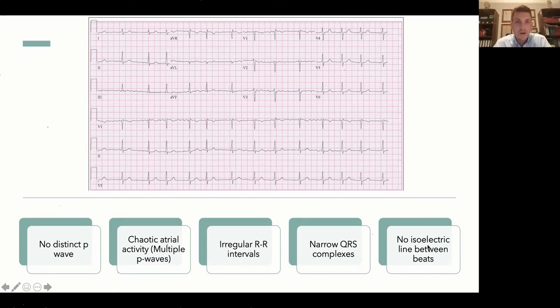When a heart cycle finishes, there should be a small isoelectric decline before the next part begins. But this is not the case here. You see that there is constant jittering of the line before another QRS. The QRSs are actually fine. They're narrow, tall, no biggie. But the intervals from here to here are irregular. So this is an irregular rhythm.